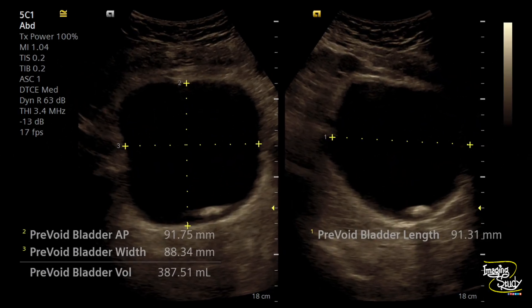Let's see what we have got on ultrasound. Here you can see we have checked the pre-voidal urinary bladder. The bladder wall looks quite smooth. Pre-voidal volume was around 390 ml. You can also see a bright echogenic structure casting faint acoustic shadow, located at the dependent part of the urinary bladder lumen.